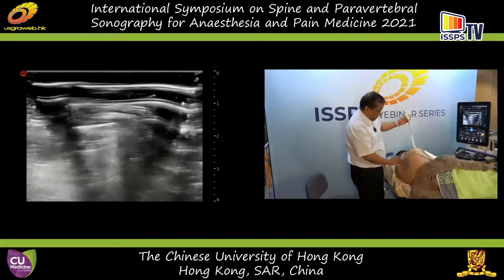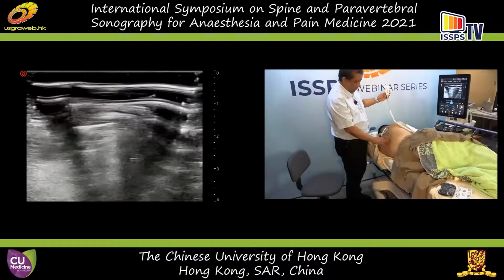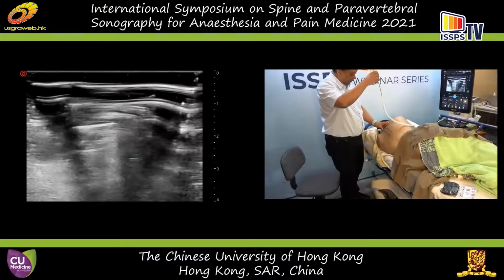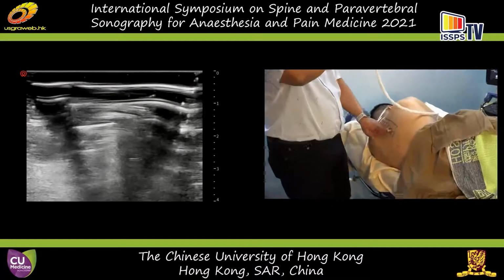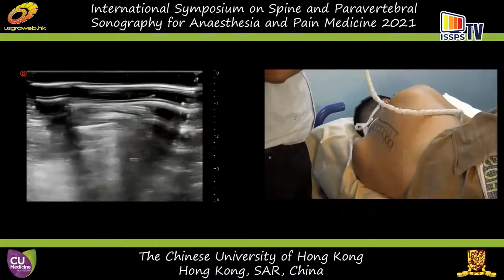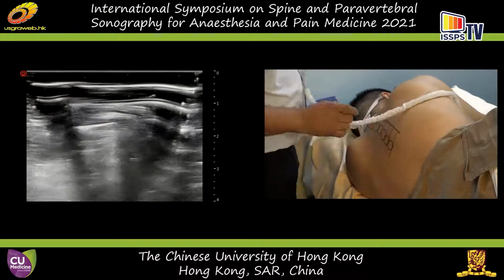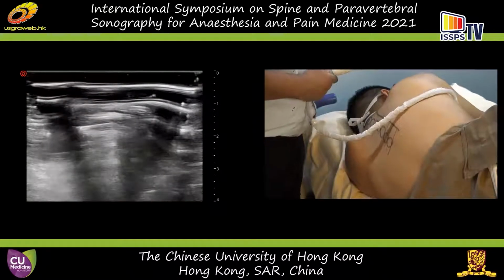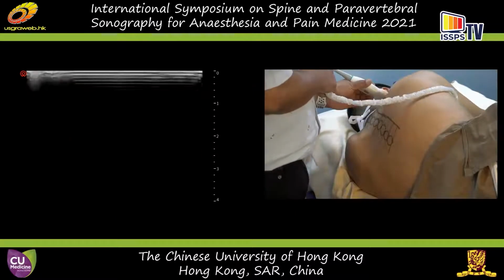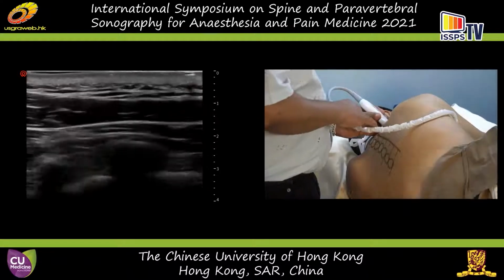So today, as you can see here, Ranjit, my fellow, has very kindly put some landmarks here. The oval structures are the spinous processes, and then you have the interspinous spaces in between. We are going to focus our attention mostly in the mid-thoracic region. But let's come first to try and see if we can identify the ribs, and how to identify a given vertebral level.